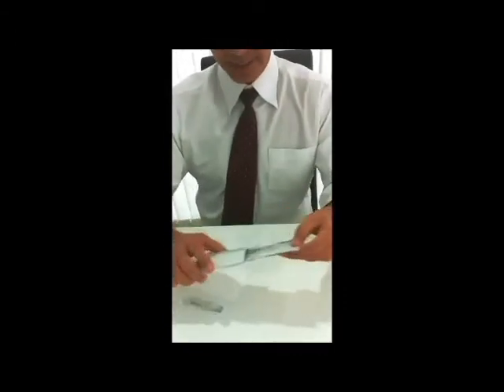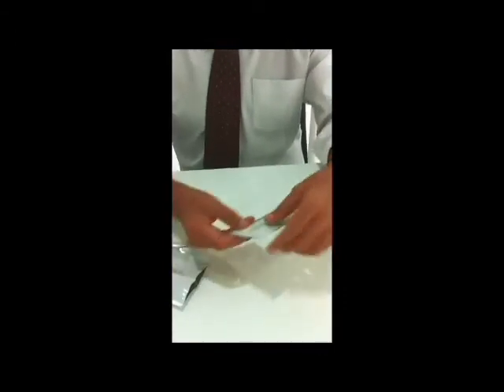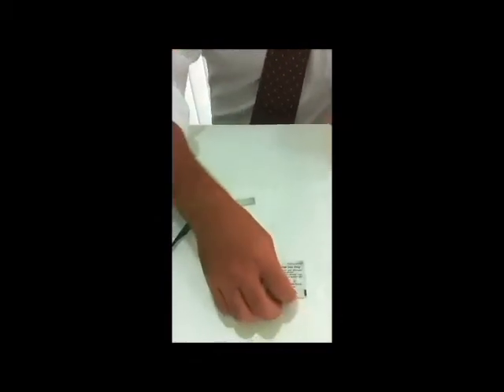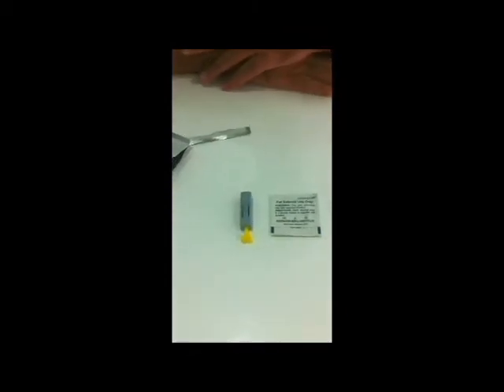On opening this inner packet, you will also see the blood test kit, a buffer, an alcohol swab, and what's called a lancet.